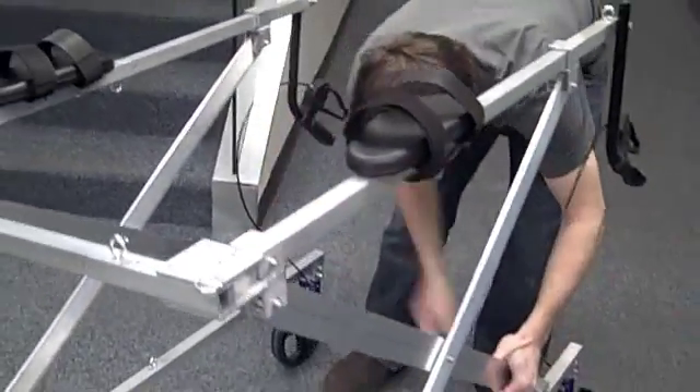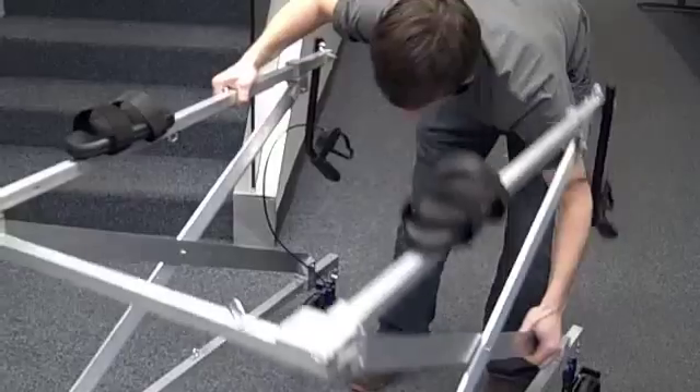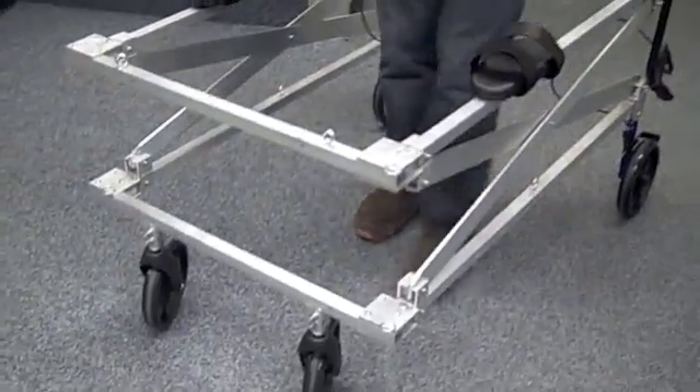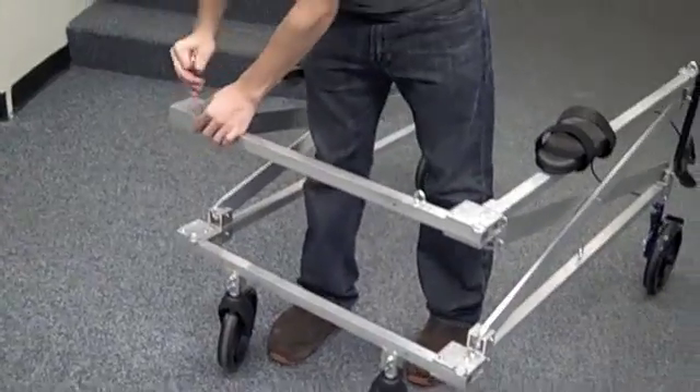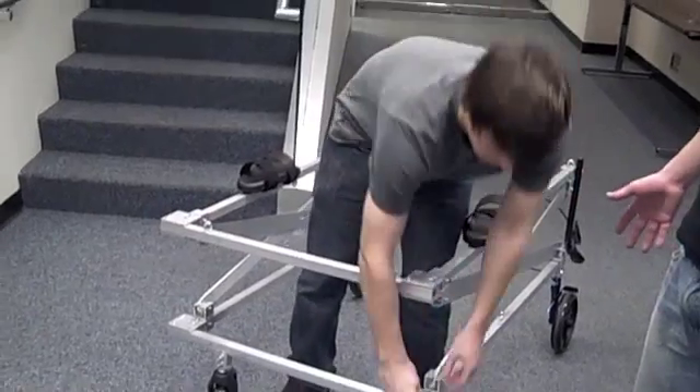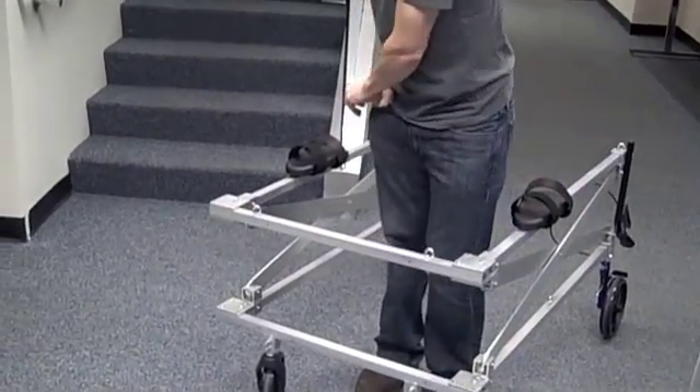Right now he's taking these pins out that lock the scissor linkage bars in place, and the device collapses to a smaller height. After that you can take these pins located on the hinge plates out, which allows the sides of the frame to fold out and around.